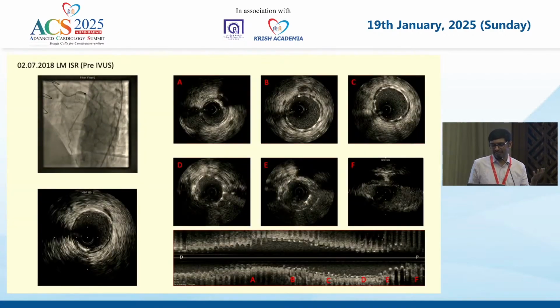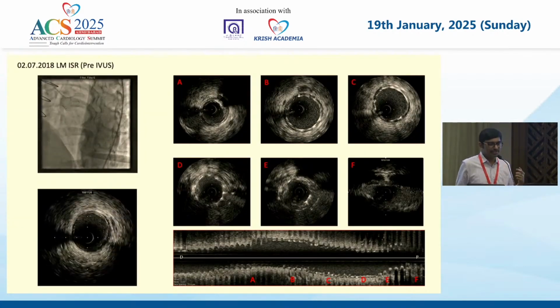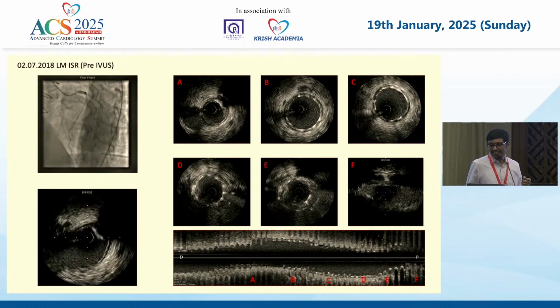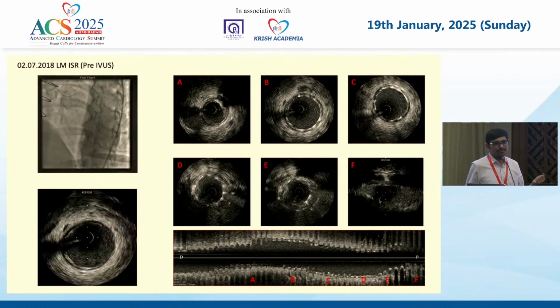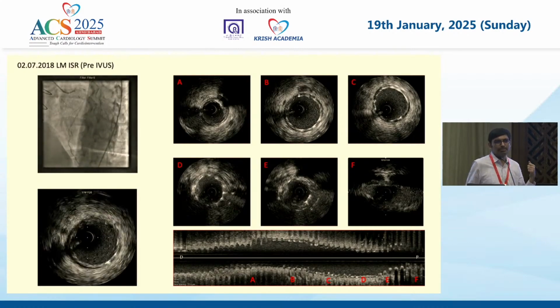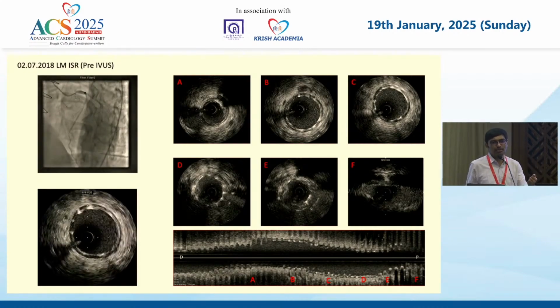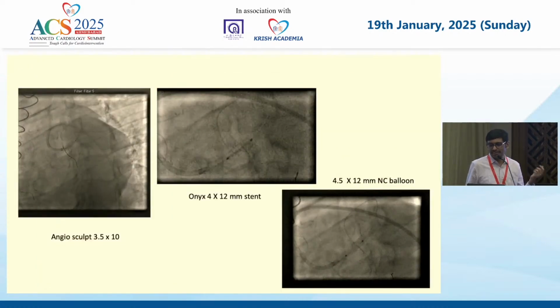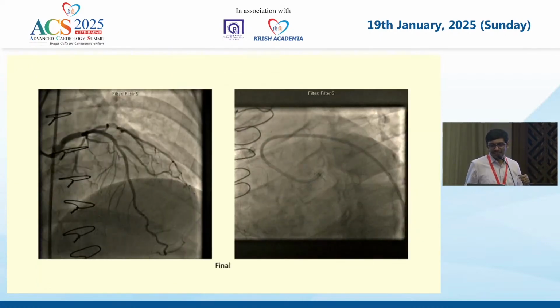And we did the IVUS imaging. Any comment on this IVUS imaging? The reason is longitudinal stent deformation because there's much crowding, most probably when you pulled back the IVUS catheter or pulled back your guiding, that has deformed your stent. So this time we went back and dilated. Fortunately, for the past 6 years, he's doing well. Still he's alive and doing well, and no further events.